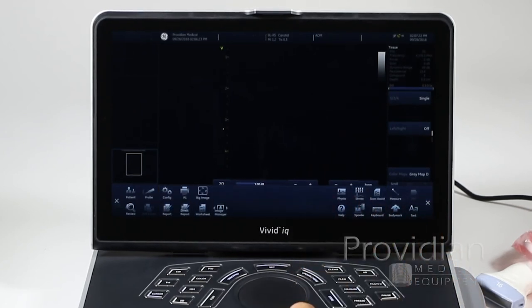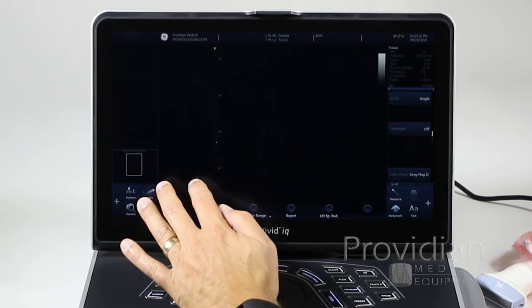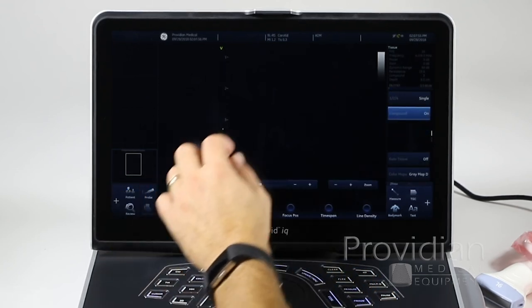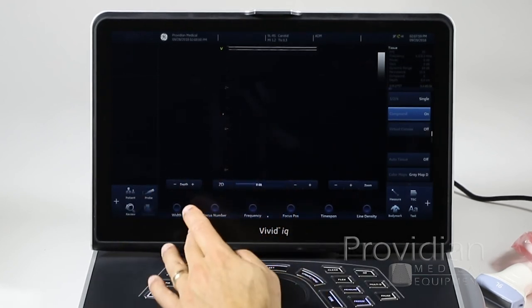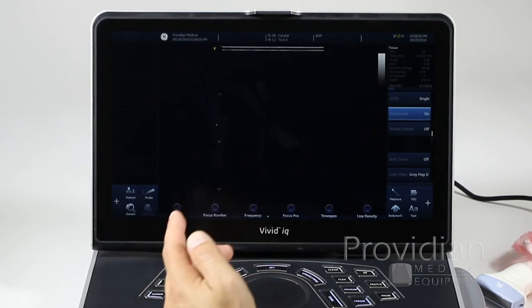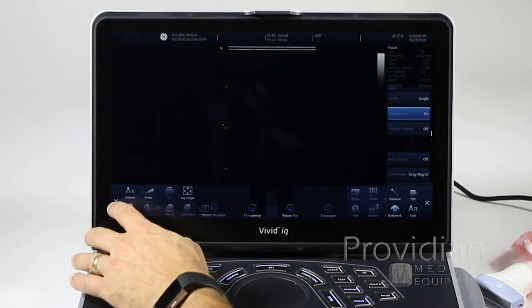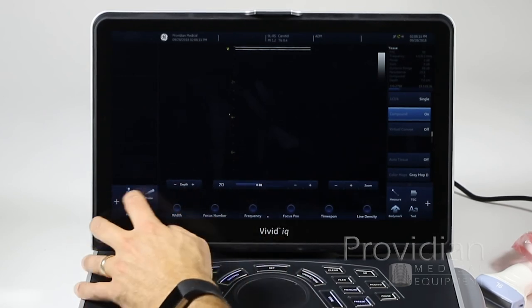You can also tap the main image to go to a larger full screen view, which drops the gain bar. In full screen mode, you can still adjust the depth, but for the gain you'd need to go back to the smaller image view. Zoom and pinch gestures still work in full screen.